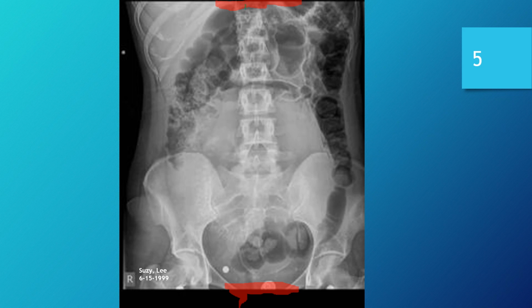Positioning. Well, let's draw some lines here and see what we can come up with. As you can see, it looks to me, mid-sagittally, the image is positioned well. It's favoring the left side just a bit. Fortunately, it did not cut off any pertinent information in terms of internal structures of the bowel.